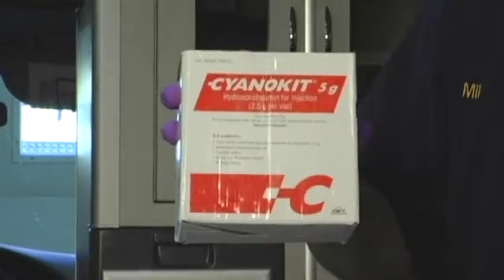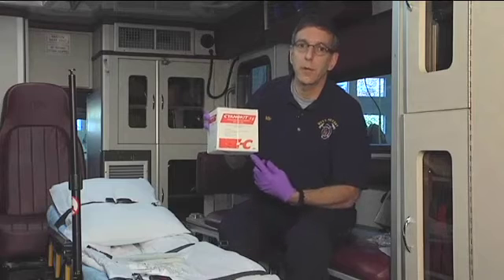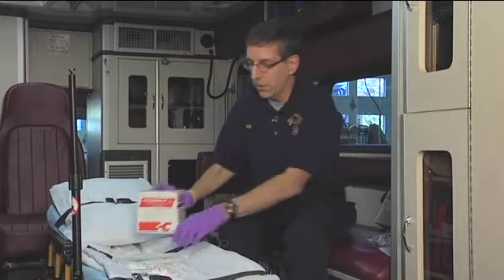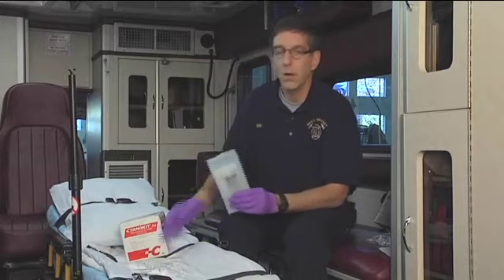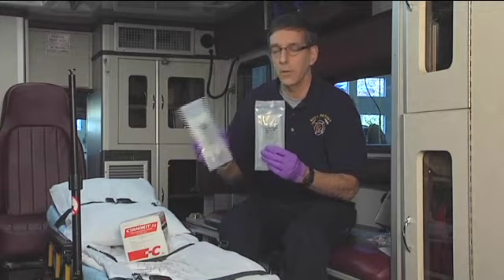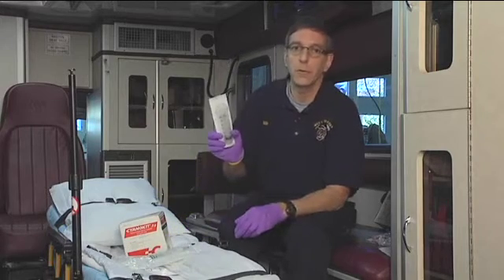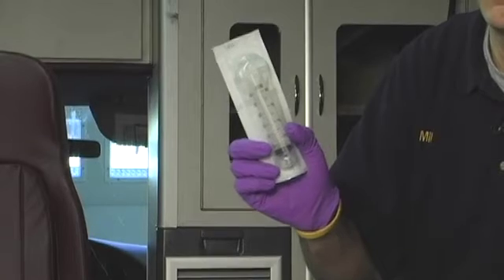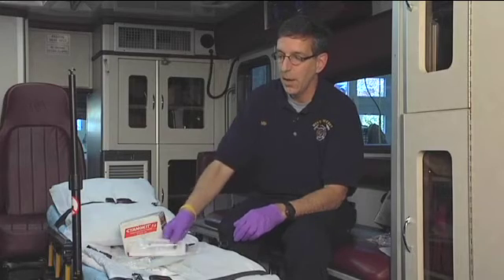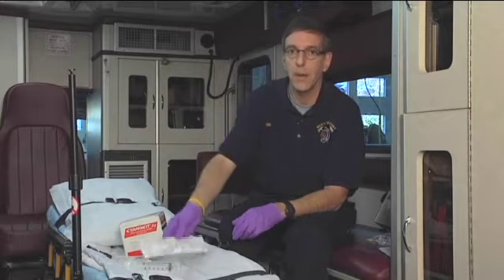The kit itself is not enough — you need additional supplies. Beyond the kit, which contains the medication and mixing spikes, you'll also need two 100 mL bags of normal saline, a syringe to pull medication from the vial and administer it into an intravenous port, and more than likely a stopcock to connect the syringe to — we'll come back to the stopcock later.